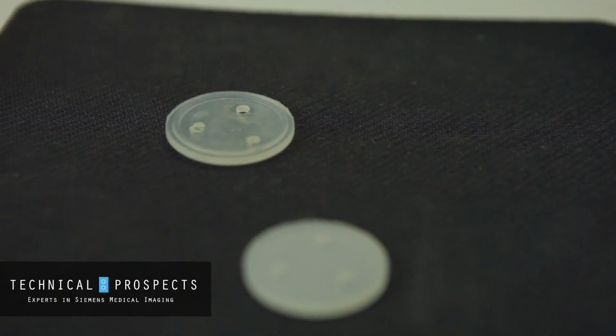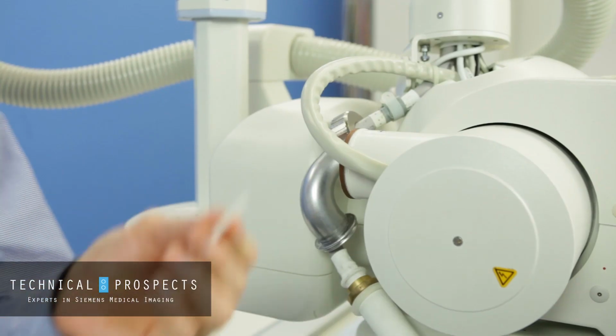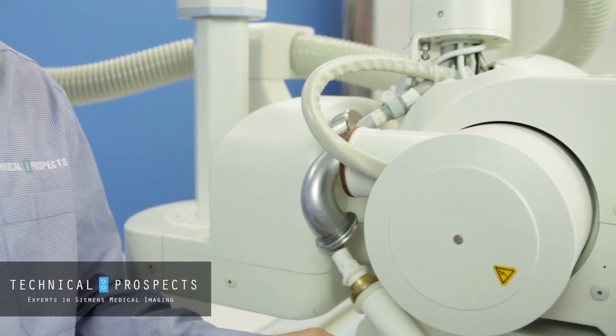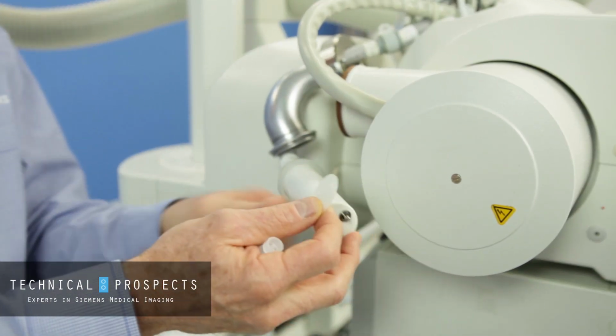Some of these discs have a rib and some of them don't. If you have a rib, it's important to know that the rib always goes against the candlestick. It provides a buffer.